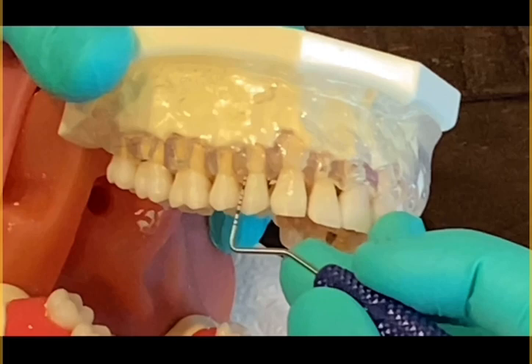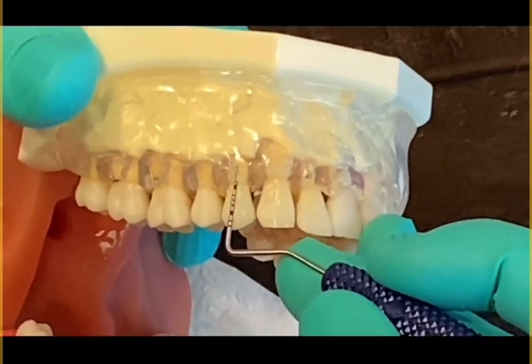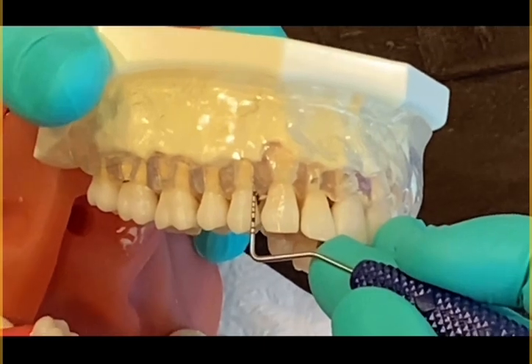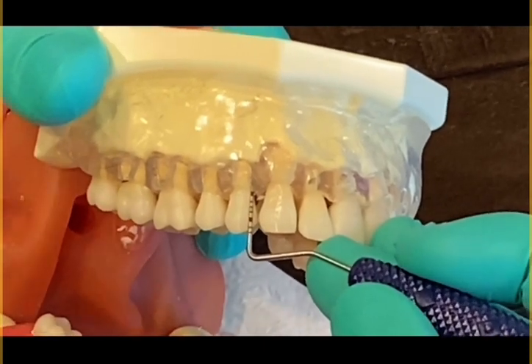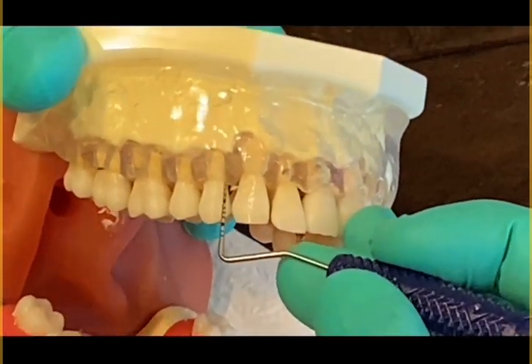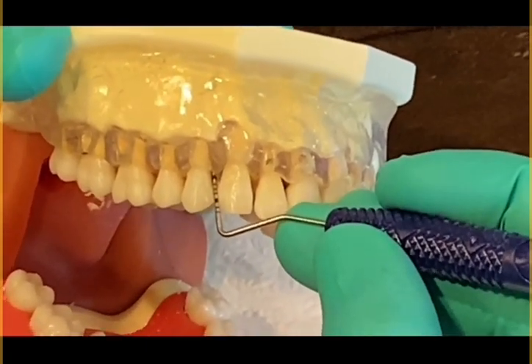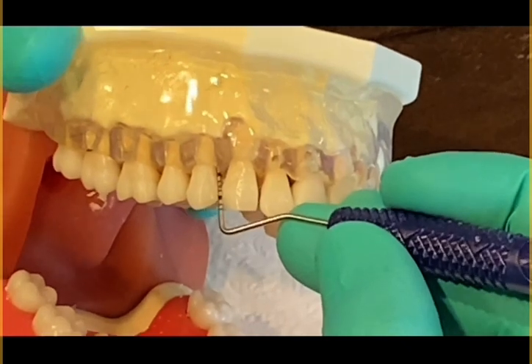I will then go from the distal line angle, walking, to the mesial line angle, and that is a 4 millimeter pocket. I will then go from the mesial line angle into proximal and tilt to get into the col space, which is also a 4 millimeter pocket.